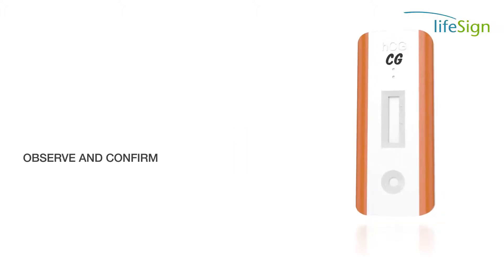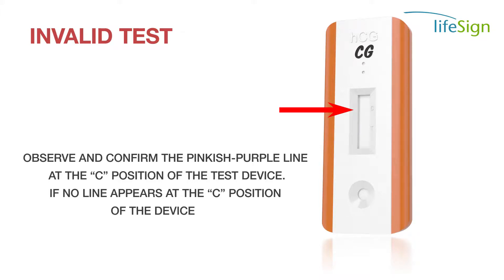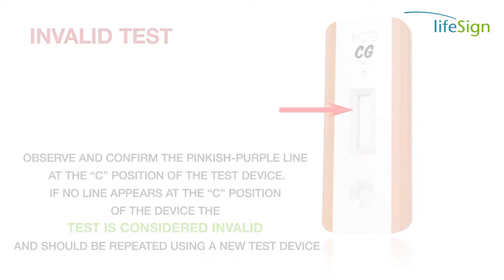Observe and confirm the pinkish-purple line at the C position of the test device. If no line appears at the C position of the device, the test is considered invalid and should be repeated using a new test device.